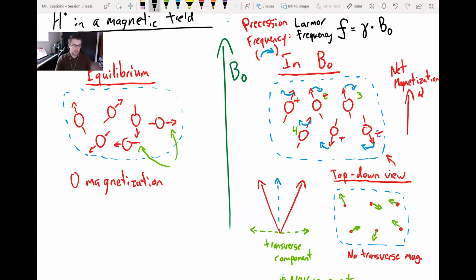The gyromagnetic ratio is a constant that is different for each particle that we're looking at, or each atom. For the hydrogen atom, it is like 42 point something. I will say 5. I think it's like 0.6 or something like that. Maybe I should look that up. Maybe I should have before today. But the units are megahertz per Tesla.